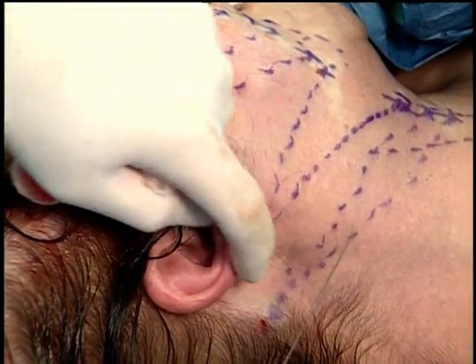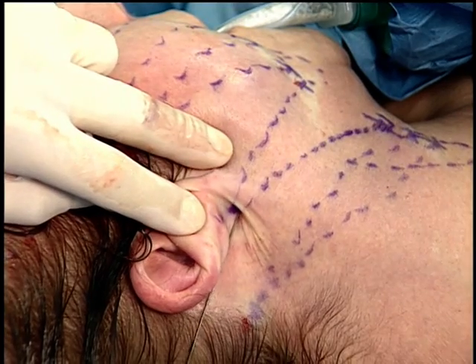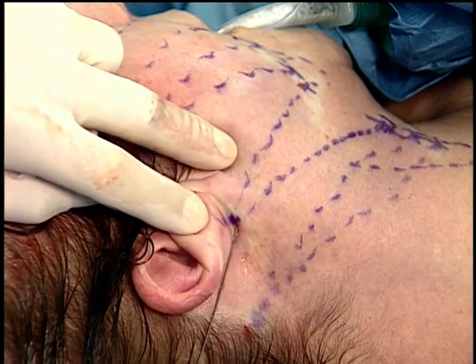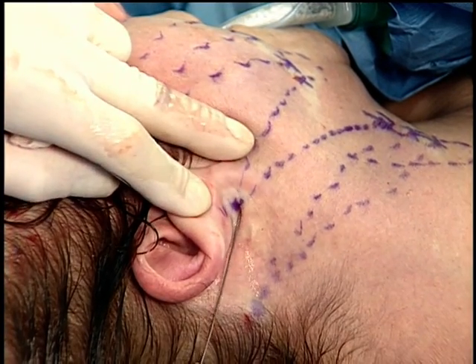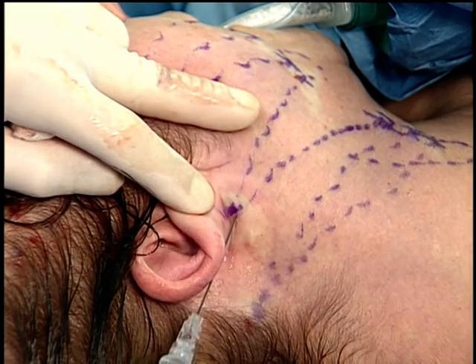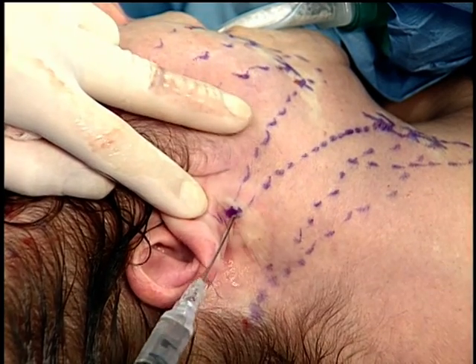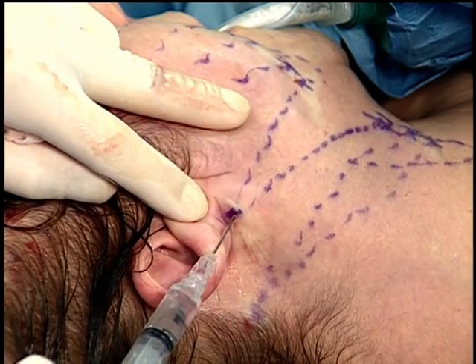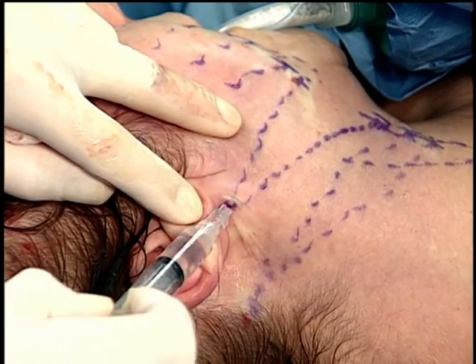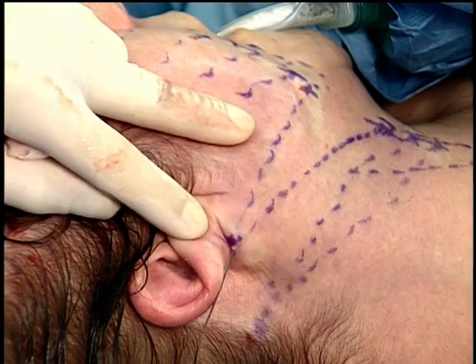Now we're going to come under the lobule to our jawline defining anchor and deployment port, and extend out into the jaw. Now this is very adherent over the parotid fascia and SMAS. Make sure you dissect off the fat on your way down. Stay above SMAS, not in the SMAS, and above platysma. When you get to your exit point, inject on the way back and dissect that tissue off.